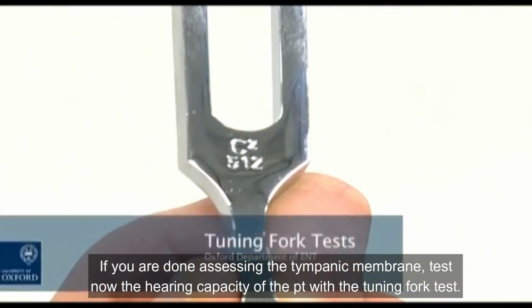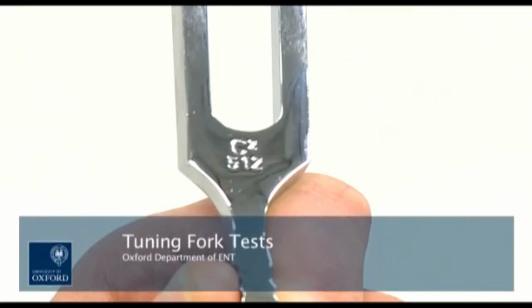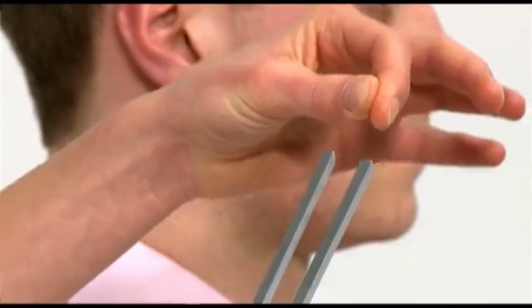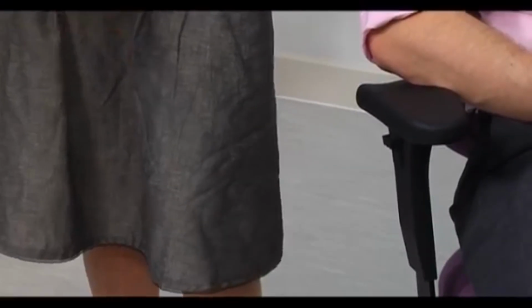Tuning fork tests are useful in assessing hearing loss. This video shows how to perform Rinne and Weber's tests. These tests are performed using a 512 Hz tuning fork. The tuning fork can be activated by flicking it between your fingers or by tapping the tuning fork on the knee.